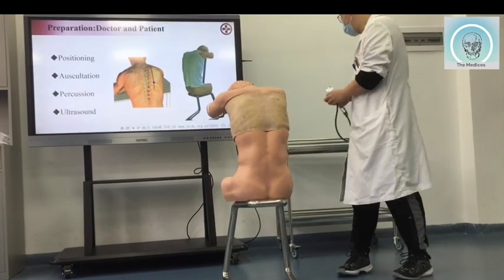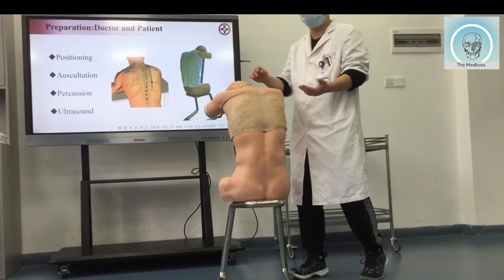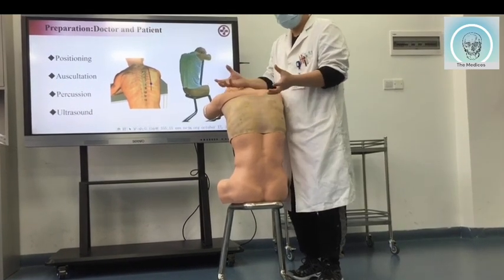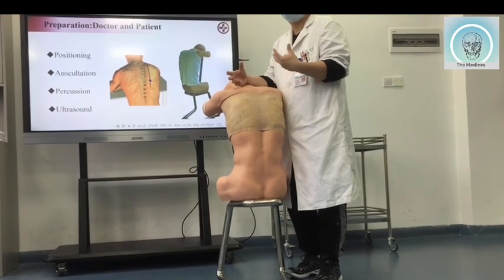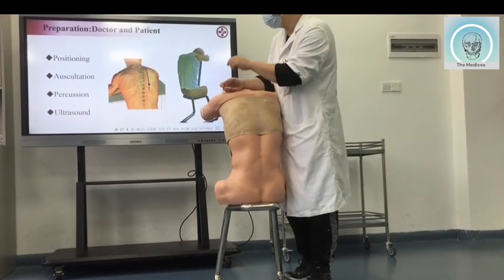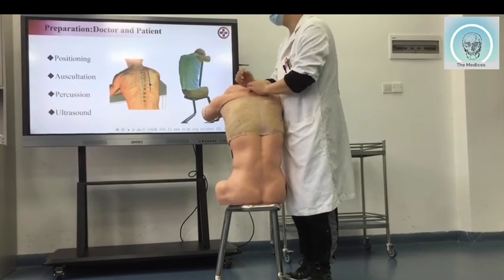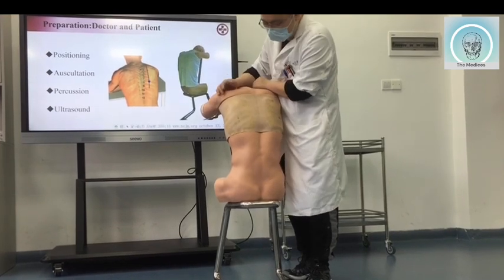And sometimes in such special times, when the patient cannot do this, or sometimes at one point, you can use the ultrasound and you can see the effusion.